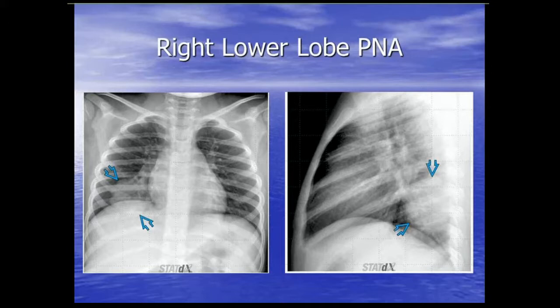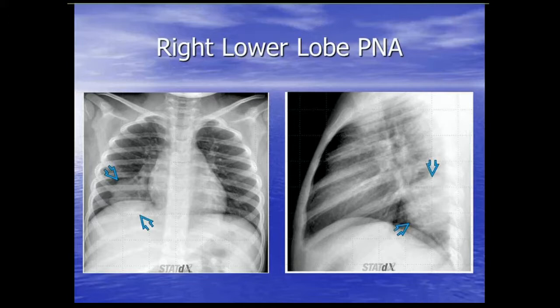This is more classic for pediatrics: a round lesion in the right lower lung. Based on the lateral, you can clearly tell it's in the right lower lobe — this was a round pneumonia. Kids get round pneumonias because they have pores of Kohn and canals of Lambert that haven't quite developed, so pneumonias can look like masses. We generally see this before age 8 and definitely not after 12. I would still get a follow-up chest x-ray in about six weeks to document resolution.